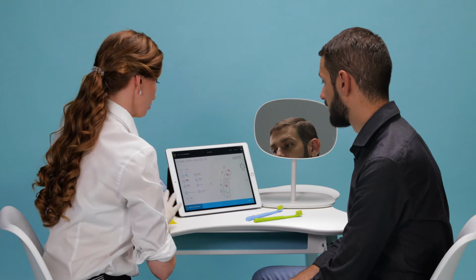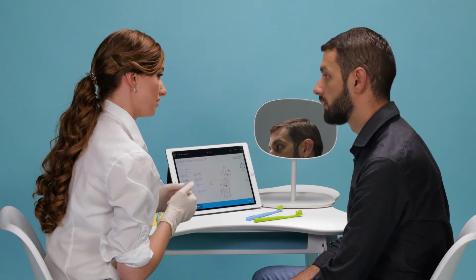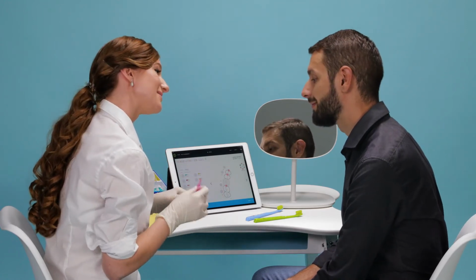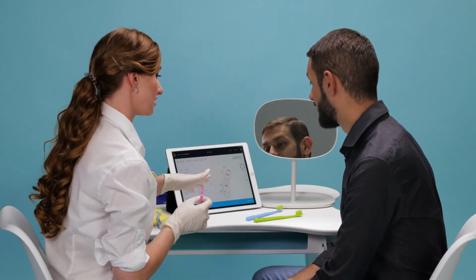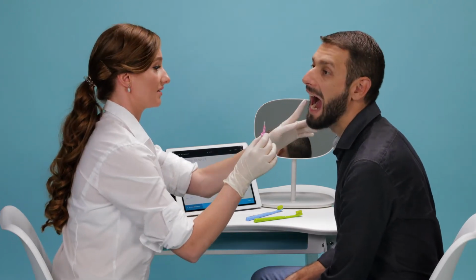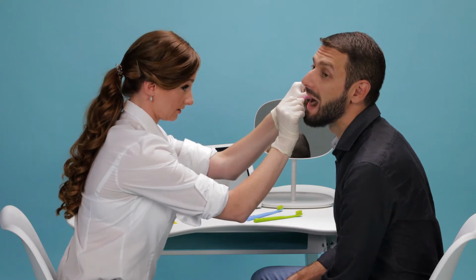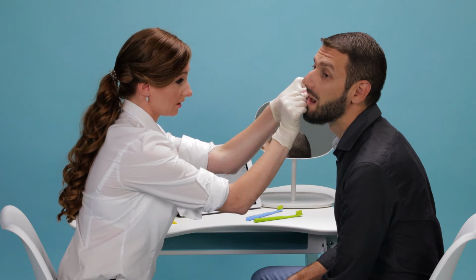As I have completed a Bob score on Edward before, I can view the colour of the previous interdental brushes by the colour of the circle adjacent to each interdental space on the chart. My patient is also able to view his assessment by the mirror in front of him. This is part of the Bob Interactive method, and today we complete this by using the IDB only method with OHI simultaneously. I begin with the pink prime interdental brush and check if this brush is still appropriate to use in this area.